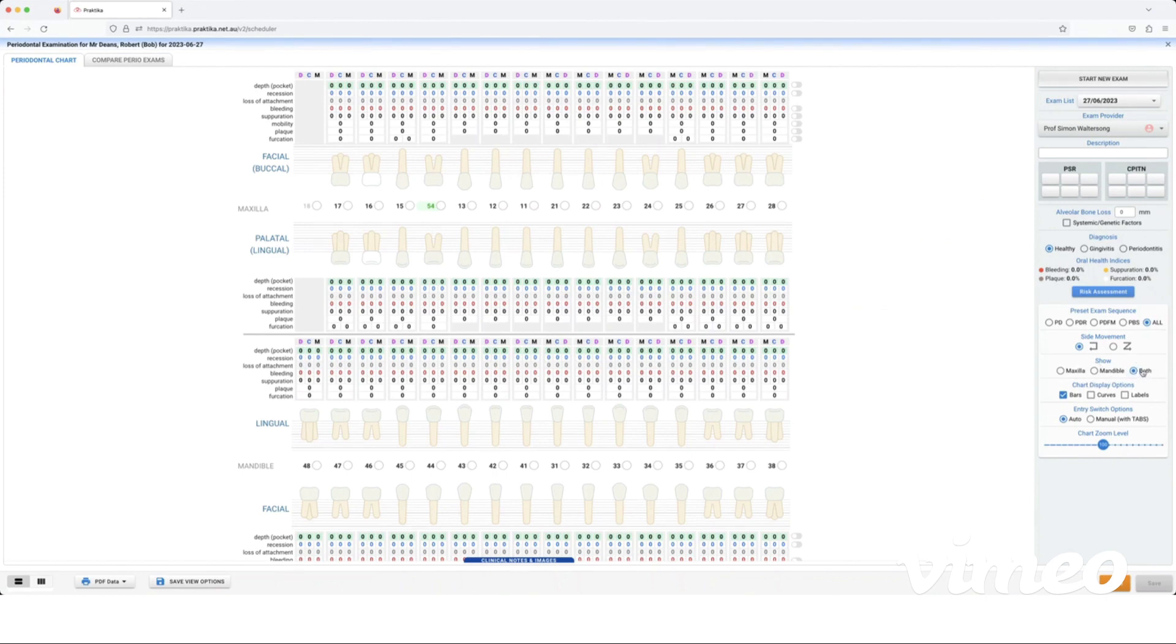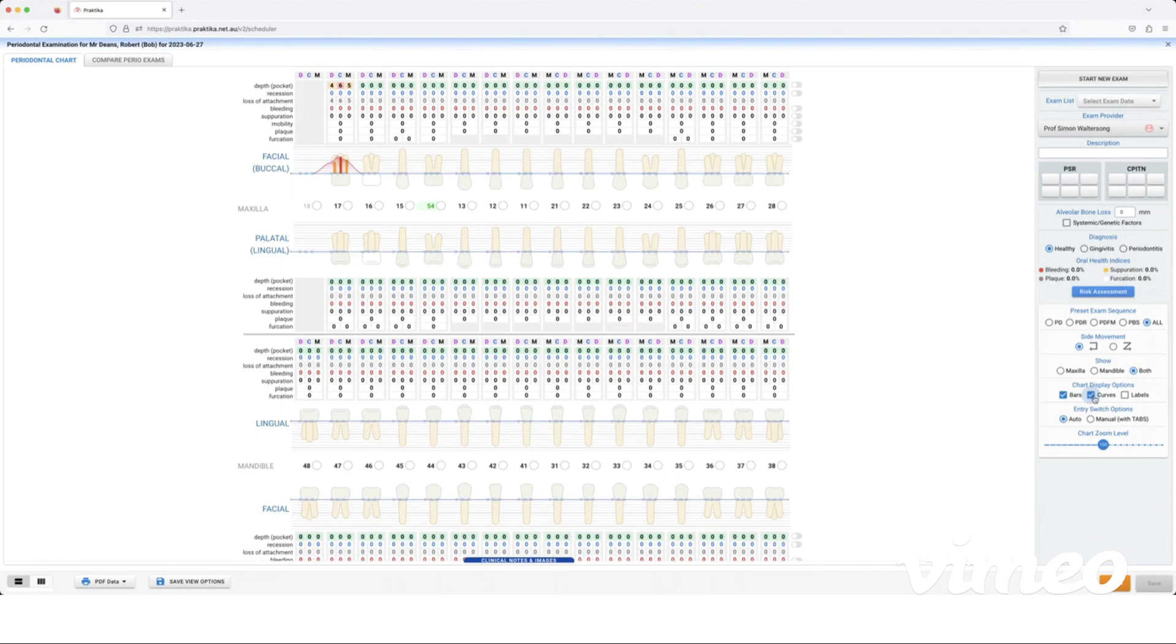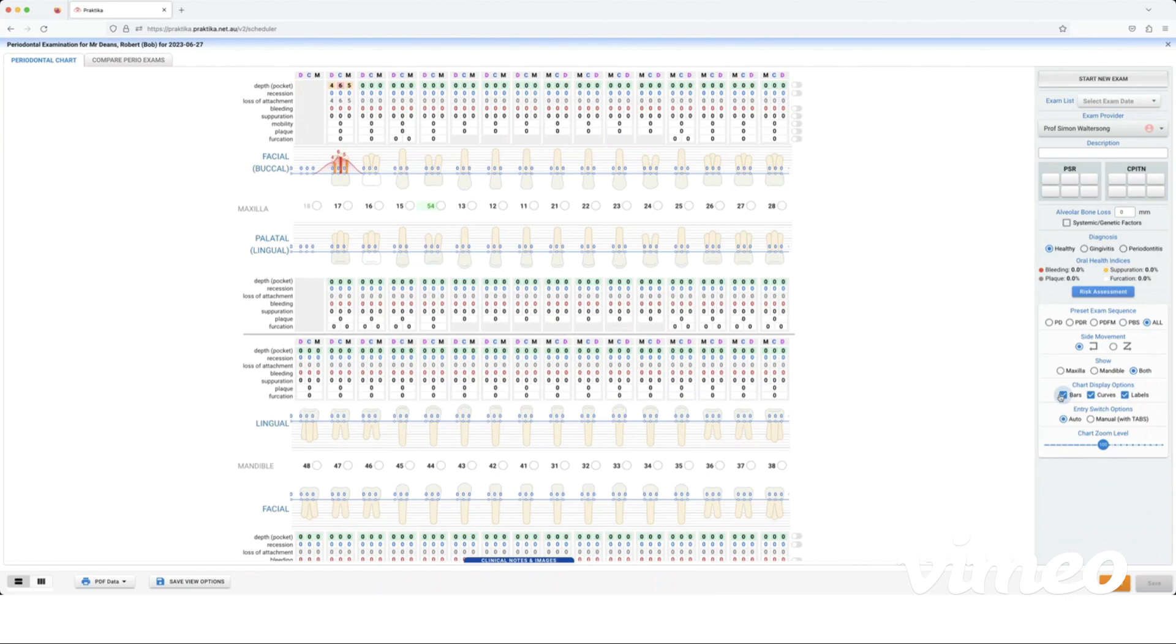Chart display options: this is referring to charting some numbers in the pocket depth here for the one seven. So this is on bars at the moment, we're getting the bars appear on the actual teeth root surfaces. I can change that to curves or I can change it to labels.